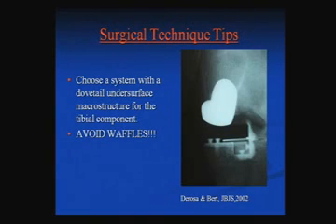Poor component design. Choose a system with a dovetail undersurface macrostructure for the tibial component. Avoid waffles. We published this in 2002 looking at shear and offset loads. And with this dovetail interface, it took about 1,200 pounds to lift this off.